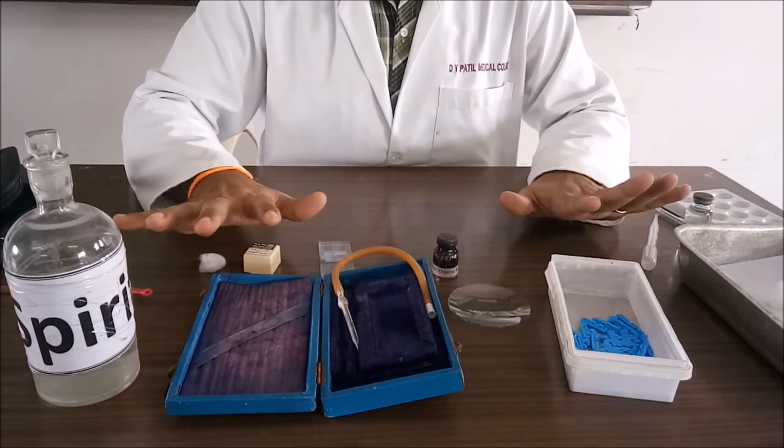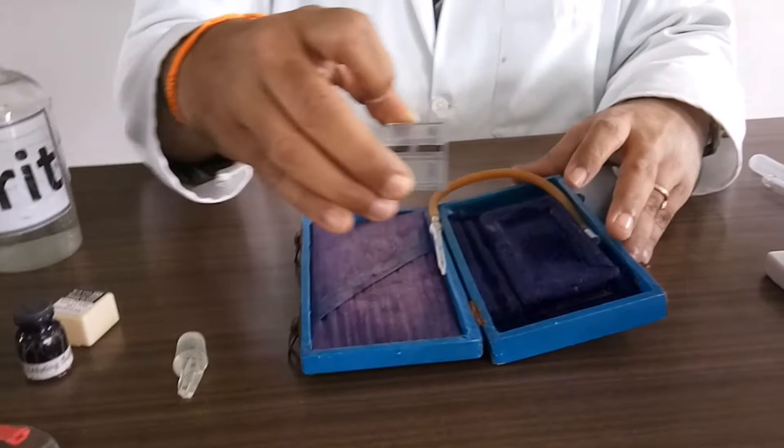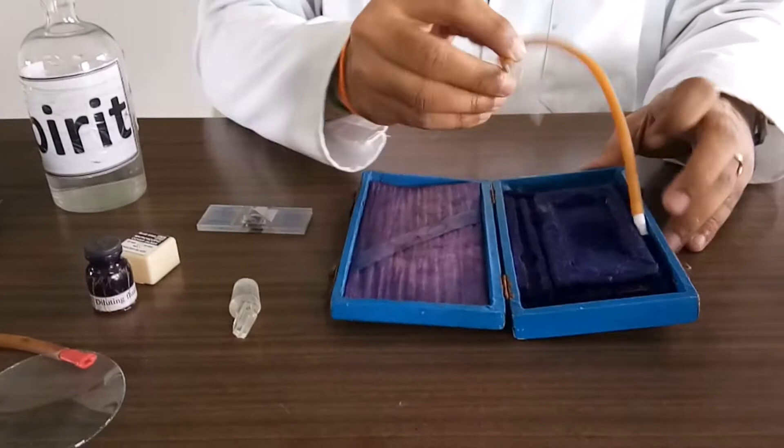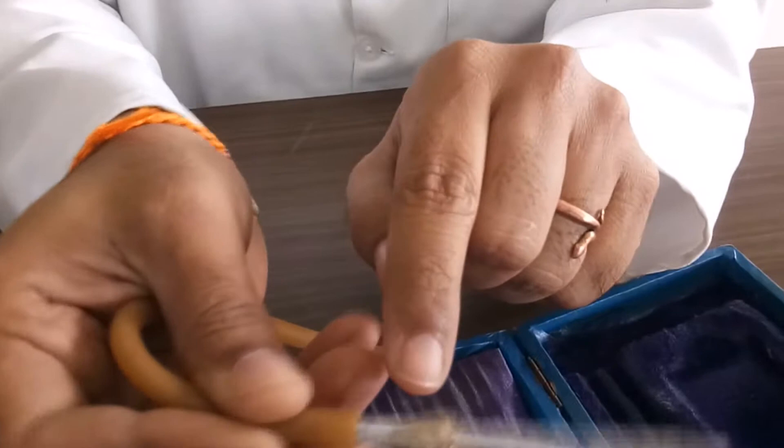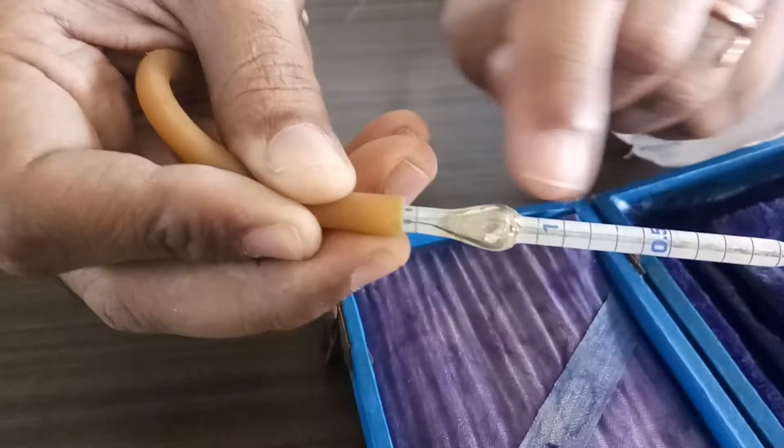Now I have cleaned, I have kept the cover slip in the Neubauer chamber. Even I have focused under that particular microscope that is low power. Now we are going to check our WBC pipette is dried or not. You can see the bead. See how freely the bead is moving, which denoting inside is fully dried.